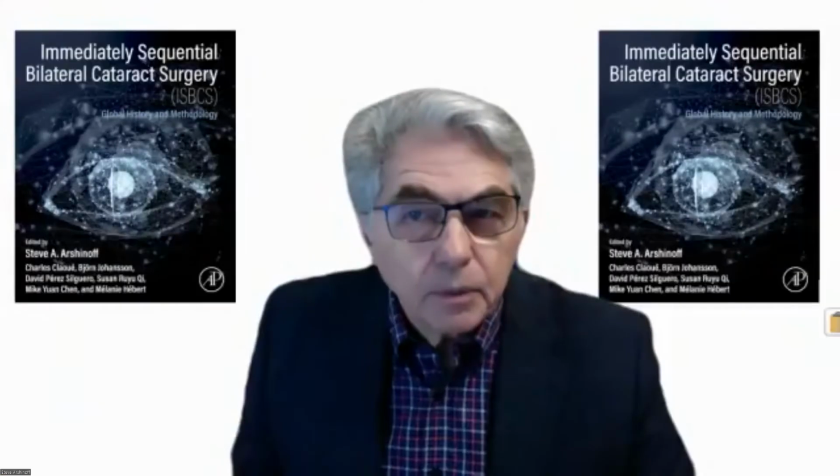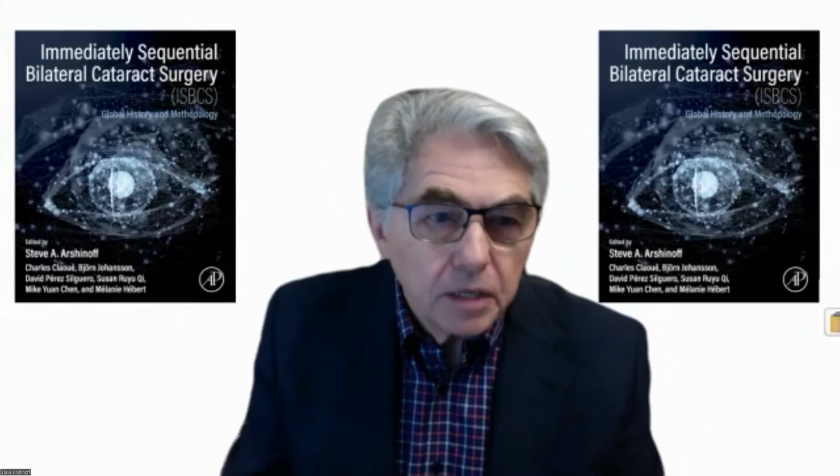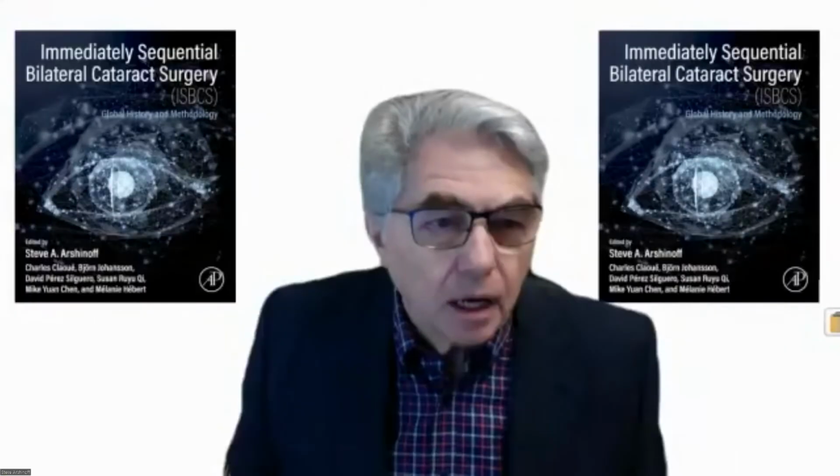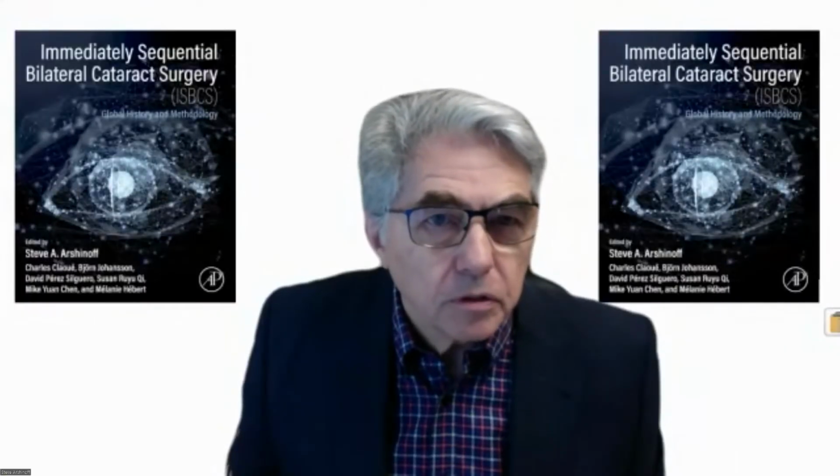Yeah, one more question, Dr. Arshinoff. Do you prefer using the dispersive and cohesive OVD in the same syringe, or do you prefer using them in different syringes and use them in a soft shell technique? I like them in different syringes because then you can place each where you want it, and not have to do it in the order that comes in the syringe. And I always prefer to use them in different syringes.